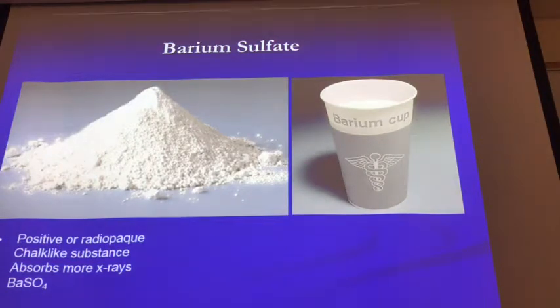All right, so this barium can be presented in many different ways. It depends on your facility, depends on what they buy. They can buy it as a powder, and then you do the mixing. You add specific amounts of water, and then you mix it and you get your barium. A lot of times they just buy it pre-made. All you got to do is shake it. Remember to shake it, because if you don't, barium will sit because it's so heavy.